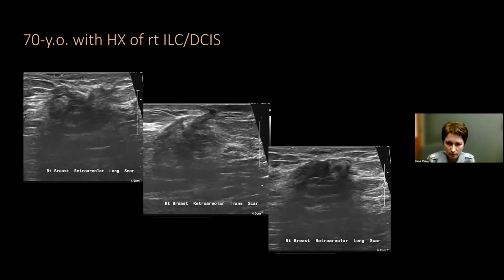If we do an ultrasound, we again expect to see very mass-like, irregular appearance with spiculations. Very hard to tell anything. If there are small masses or some new findings developing on this background, it would be very hard to tell.